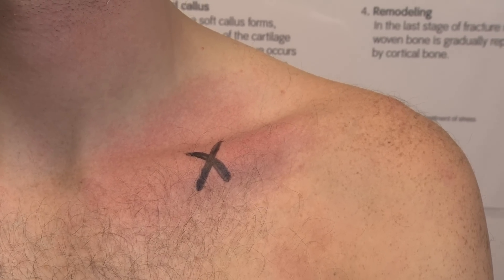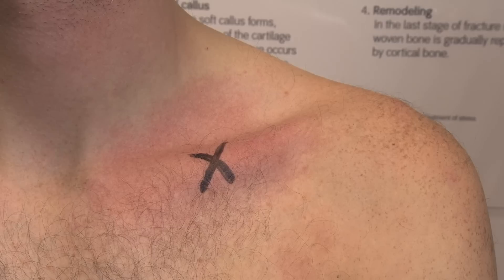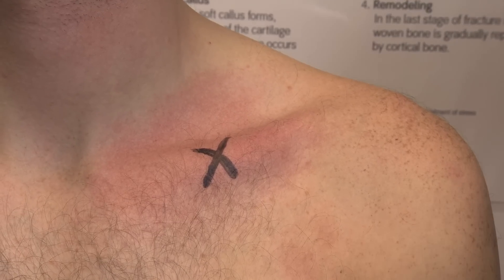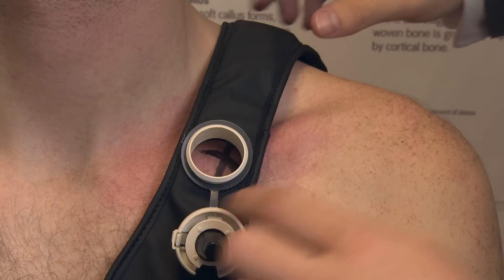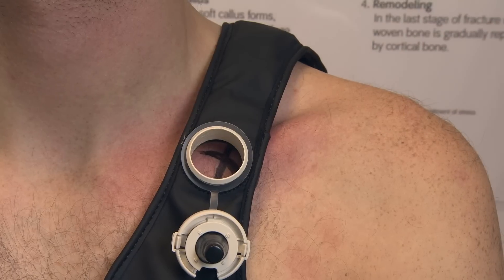Your consultant has marked on you where the fracture is, on your clavicle. I'm going to put the weighted applicator over the fracture site, like so, so that the hole is in line with the marking that the consultant made.